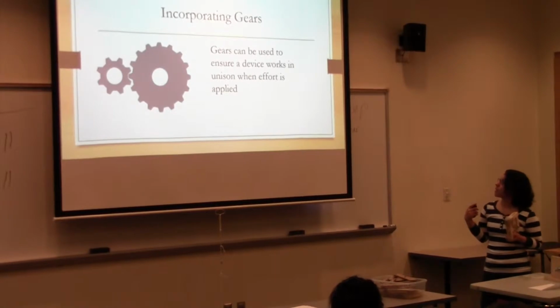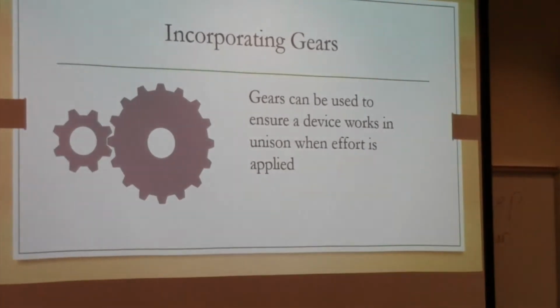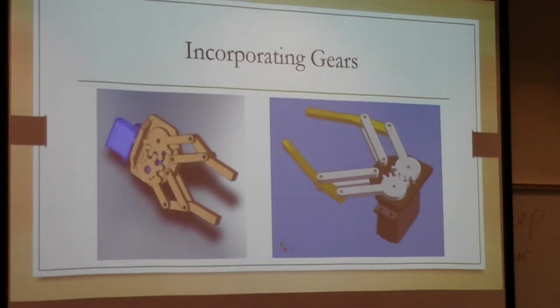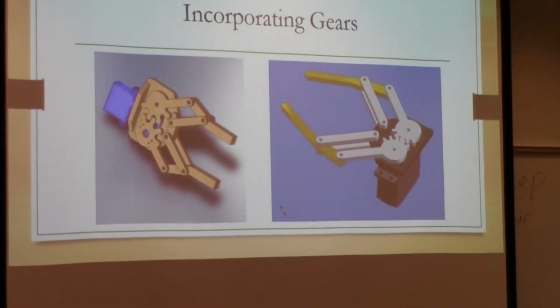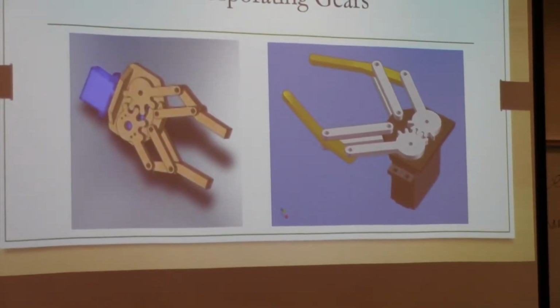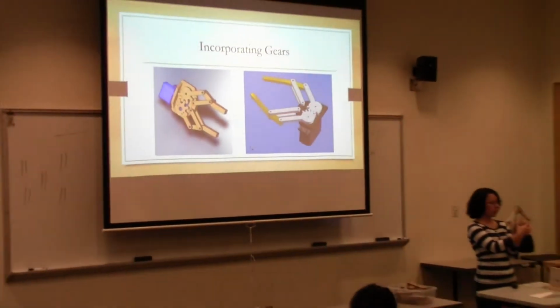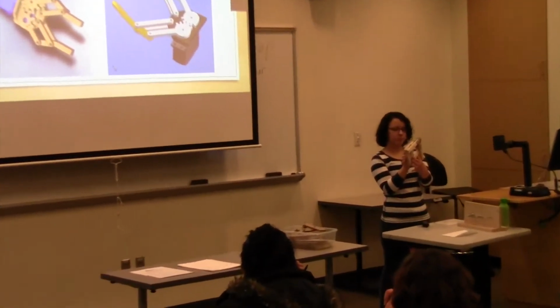And then to incorporate gears. Gears would be a good alternative to having a track. So if you guys want to go with the gears, they would make sure that it works symmetrically. So you could put the gears right in here, where you attach these members, and it would make sure that it's all working symmetrically. So it's just another alternative to building a track. It's just another thing that you guys can go with, and it might be a little bit less work. It's just another option.